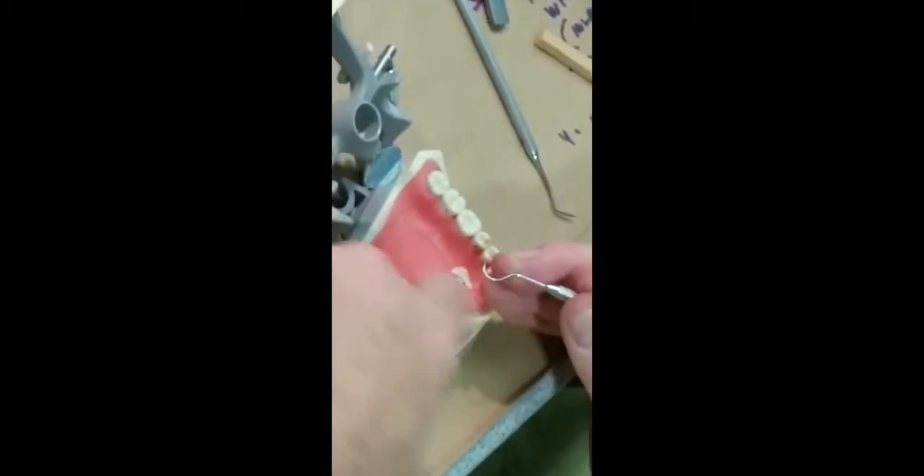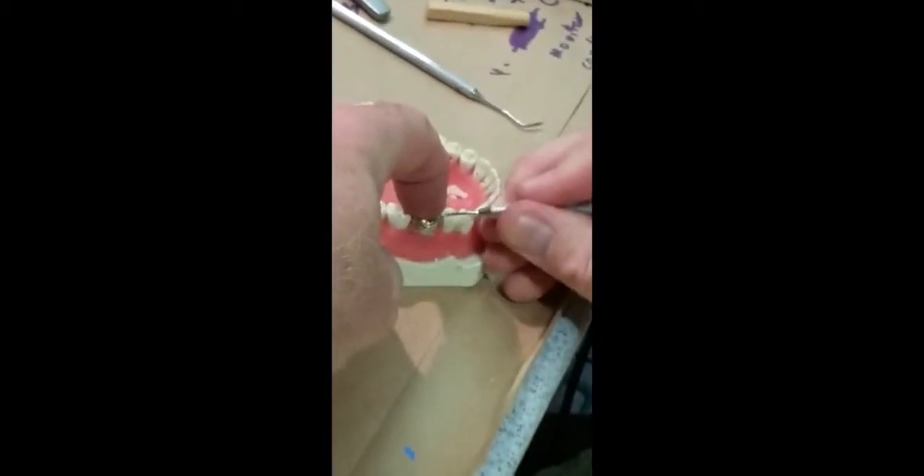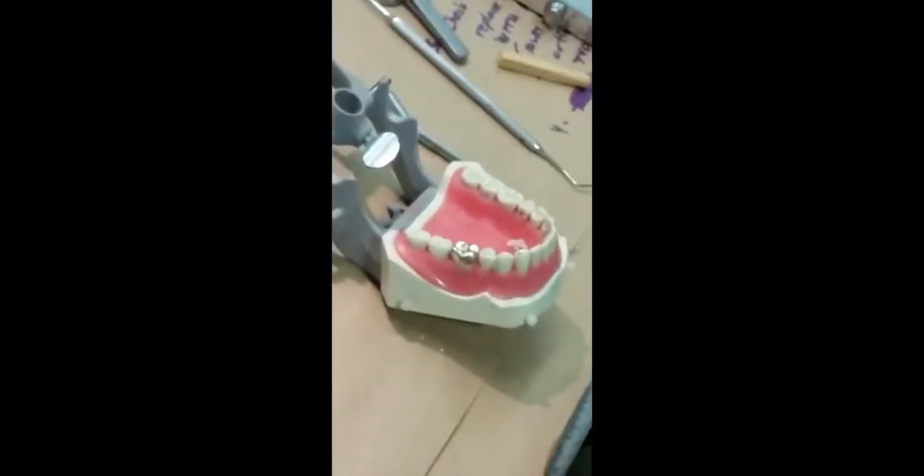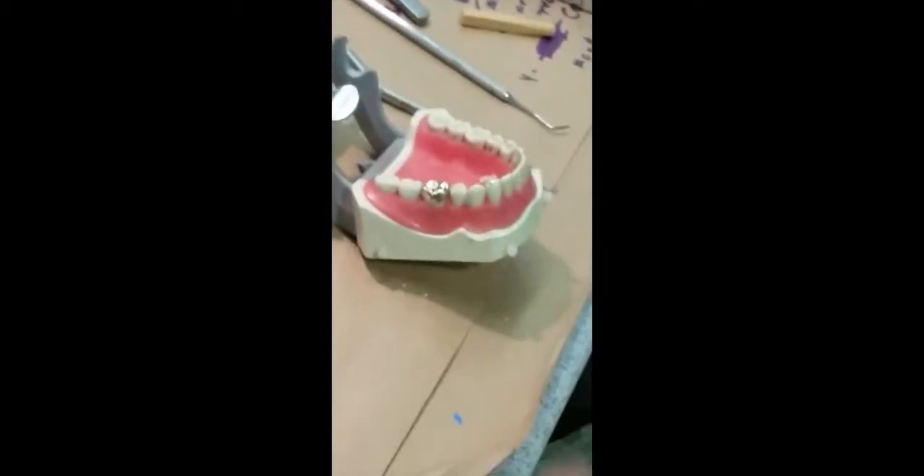Generally, that's going to get rid of all of the cement at this stage. I'm holding the crown down while I'm doing this — the cement is holding it down, but not perfectly yet. Once you've got that taken care of, your final step is to take your floss and make sure you don't feel any bumps or lumps in there.